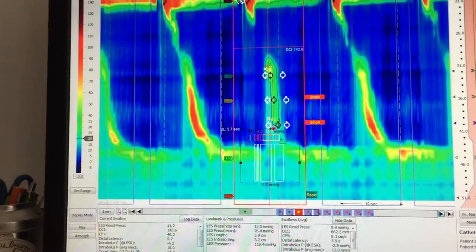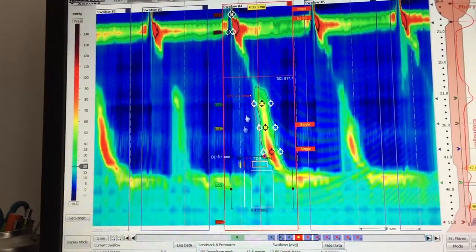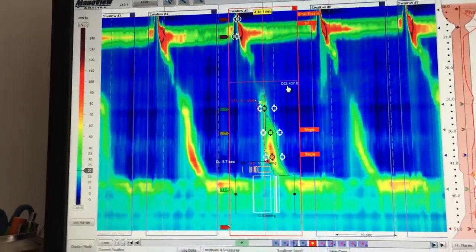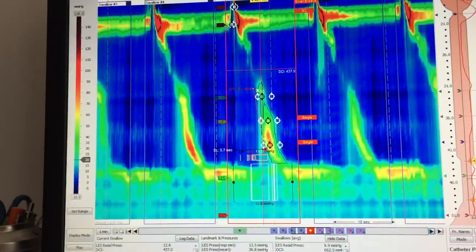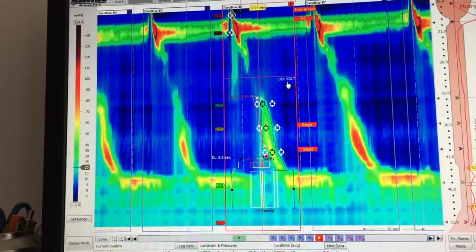Next swallow: normal DCI, normal IRP, normal distal latency — this is a normal swallow. The next one again has a small DCI, so this is an ineffective swallow — the second one. Going to the next swallow: again, low DCI — another ineffective swallow.